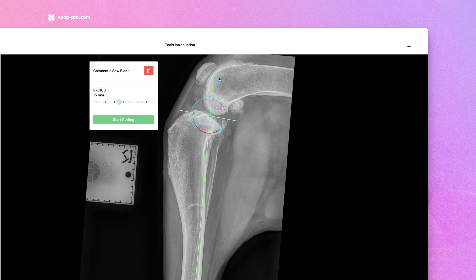Once centered, use the slider to select the radius that best fits your patient's tibial morphology. You can rotate the blade to adjust the orientation of your osteotomy and make refinements to your cortical exit points.